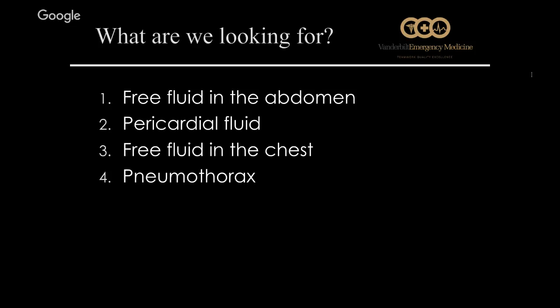So with the EFAST exam, there's going to be 4 main clinical questions that we're going to try to answer. Is there free fluid in the abdomen? Is there a pericardial effusion or pericardial fluid surrounding the heart? Is there free fluid in the chest? And is there a pneumothorax? These are going to be major causes of morbidity and mortality in trauma. And like I said, this can be used in some other situations as well. Let's say looking for free fluid in the abdomen in someone you're worried about for ectopic pregnancy, let's say. Next slide.